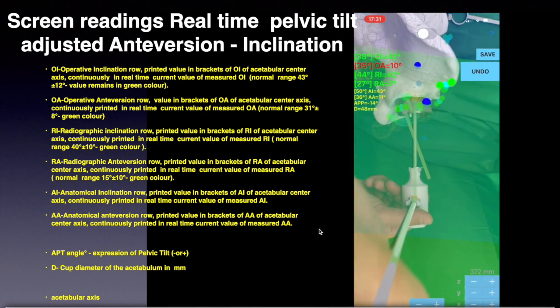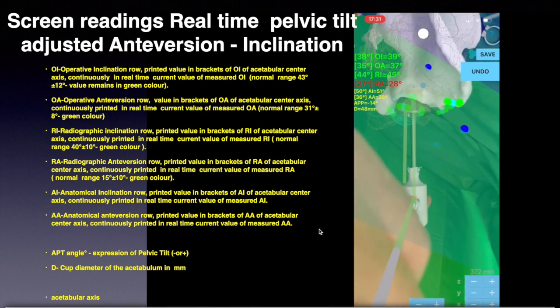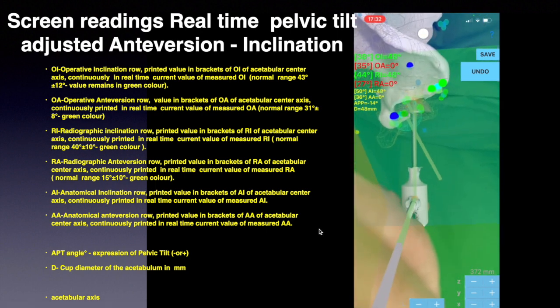By manipulating the reamer or inserter in real time, the surgeon sees values of all above-mentioned angles change respectively, obtaining positional information and directional guidance with accuracy in real time in augmented reality by observing the screen of the iPhone.